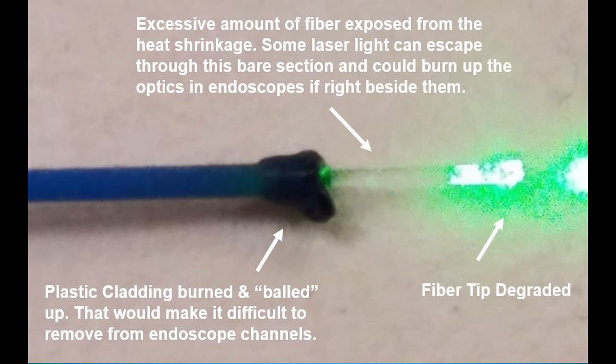You can see here that much more of the fiber is now exposed because the heat causes that plastic cladding to retract. With all of that extra fiber exposed, light actually does come out through there — not as strong as at the tip, but it comes out. And if you've got an endoscope optic right beside that, it will heat-craze it and burn it out. So that's a consideration.